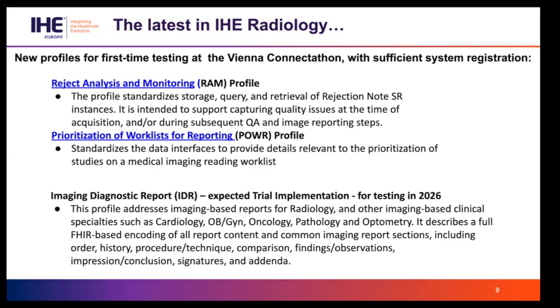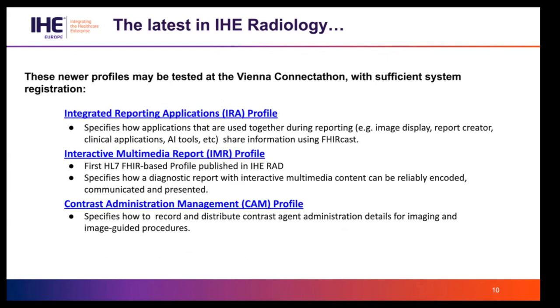That's a large profile that we have been working on for a while, and deals with the encoding of imaging-based reports, not only for radiology, but for a wide variety of imaging-based reports, and uses FHIR-based encoding as its foundation. Next slide.